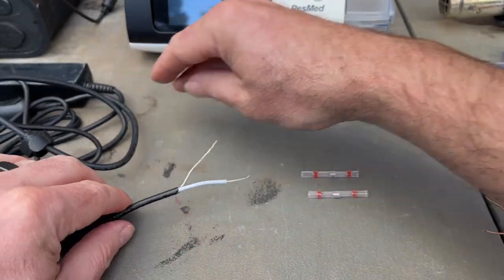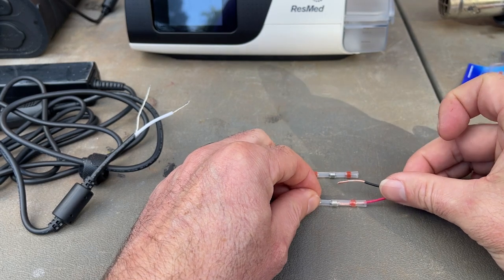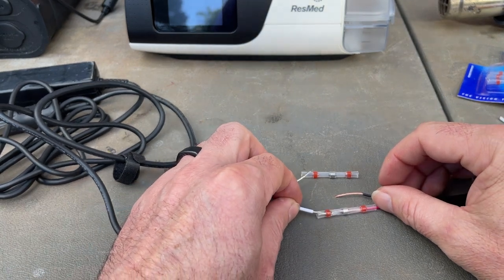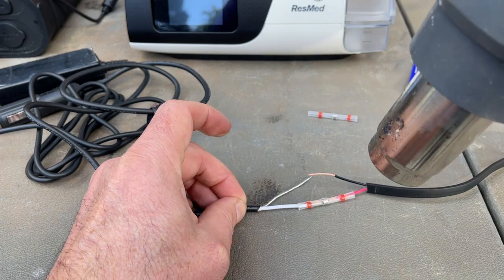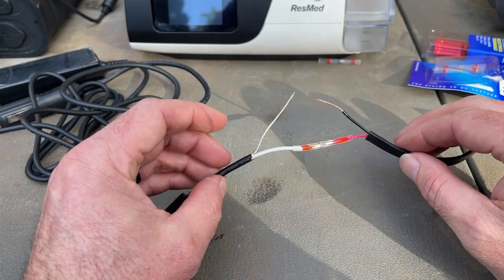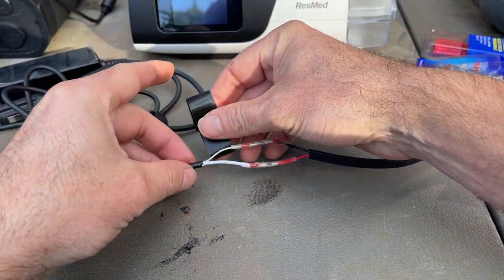We'll get a little shrink wrap on there. Now you probably don't really need to do this part, but I'm just doing it anyway.